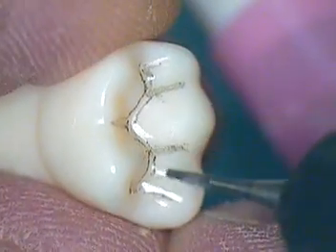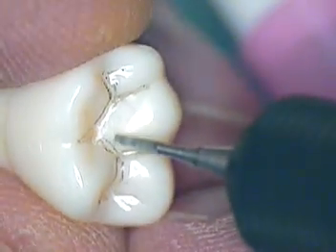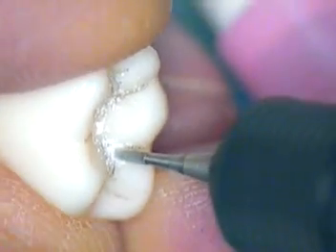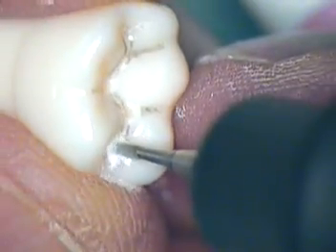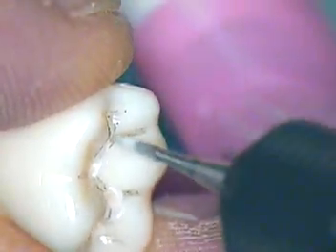The central pit is already deeper than all the other pits. Let's start by just going in a little ways — maybe about a millimeter, millimeter and a quarter — which will put you right about not quite half the distance of the bur. Now drop the next one down, going up along a ridge area here. Stay consistent with the depths. I'm using a pencil grip, keeping my bur parallel to the long axis of the tooth, straight in. You can even take a periodontal probe and just mark the depths. Make sure you've got even depths on all, because you want your pulpal floor to be even.